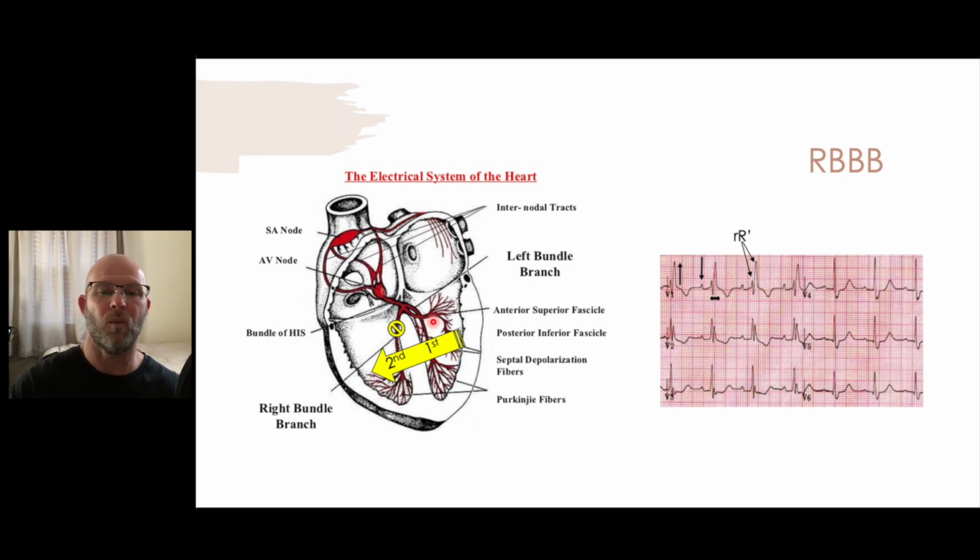So why is the QRS wide? Well, if we're all hooked up to a wire, when I get shocked, you get shocked. But if that wire's not working, cardiac cells have the ability to communicate from cell wall to cell wall, and that adds time. Width on the EKG represents time, so it took longer to go through the ventricles. The QRS is wider.